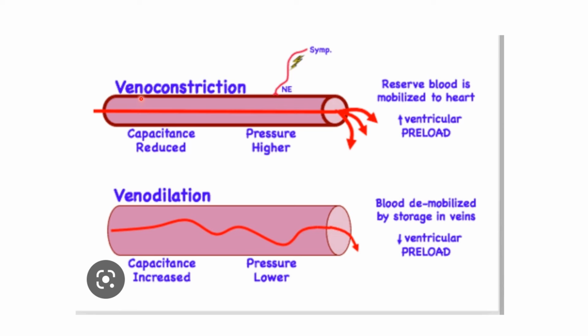Now, if your vessel wall is normal, the fluid I give will produce some lateral pressure and thus ultimately increase my mean arterial pressure. But if you have a vessel like this, despite giving fluids, your blood pressure won't increase. So till now, what you have done is you have understood whether your patient requires fluid, that is by SVV. And the second question was whether my patient is fluid responsive. That is, just by giving fluid, will my mean arterial pressure increase, or is it just a waste of time and obviously resources that I'm giving fluid, but my mean arterial pressure is not increasing.